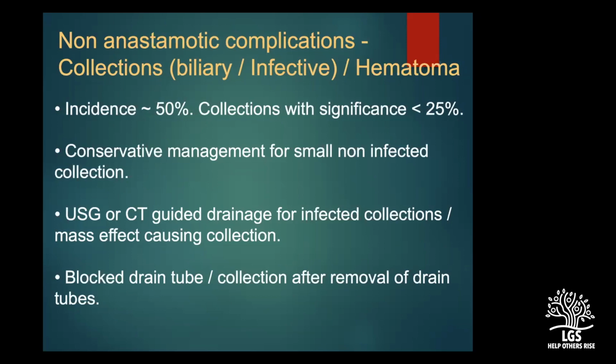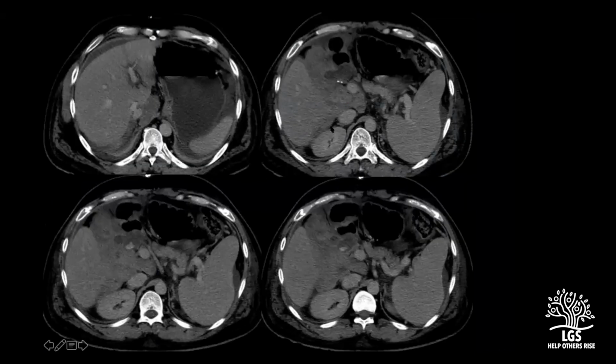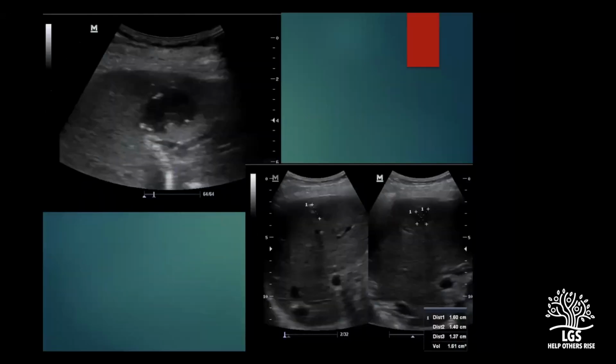As I showed in the previous slides, we can use ultrasound or CT guided drainage to drain a collection from any part. These days, we can pretty much get inside any collection for that matter, because the techniques have improved. We have a lot of methods like hydrodissection, creation of an artificial pneumothorax, creation of an artificial hydrothorax. So we can get inside the collection from various approaches. So we really don't have to worry about gaining access to the collection because of the improvement in the techniques. This is a fairly easy collection to treat. It can be as simple as that. It can be a very difficult collection with a hilar collection as well. So, no matter where it is, we have our own technique to get inside the collections and treat these patients.